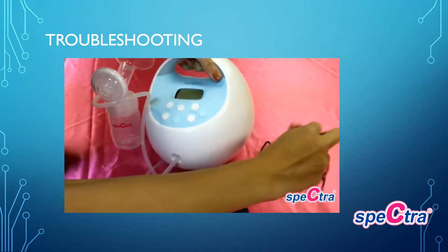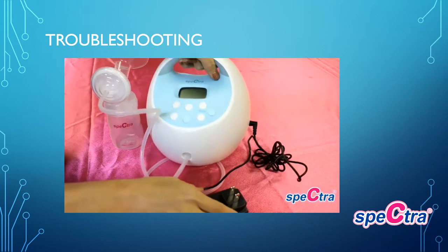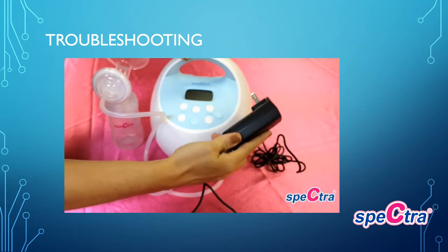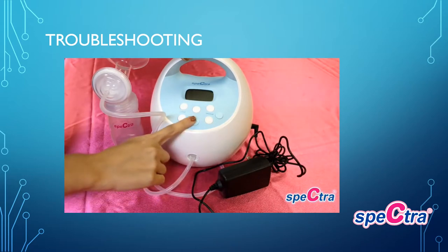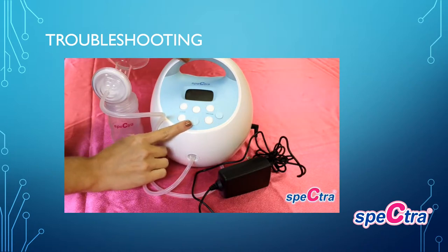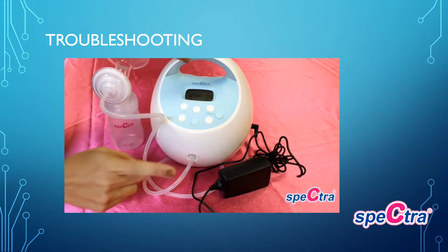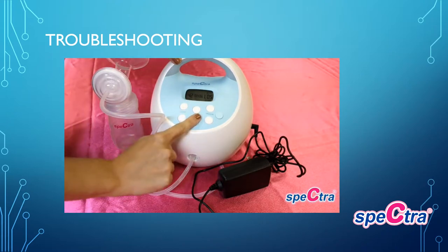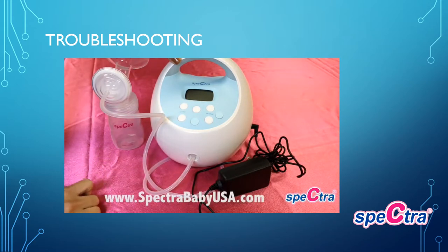Next, try replugging in your pump until you hear it click. Make sure the outlet on your wall is working and replug it into the wall. For your S2 pump, hold the power button down for 30 seconds. For your S1 pump, make sure it stays charging for four hours and then hold down the power button for 30 seconds, releasing to see if your pump turns on. After troubleshooting your power cord, if your pump still does not turn on, please contact us at SpectraBabyUSA.com for further warranty information.